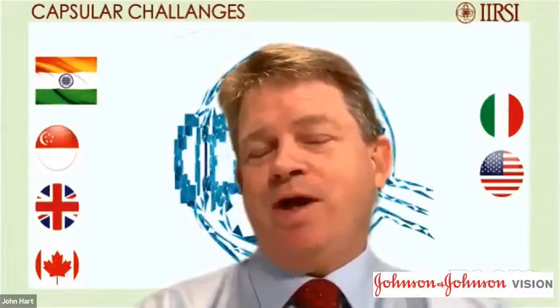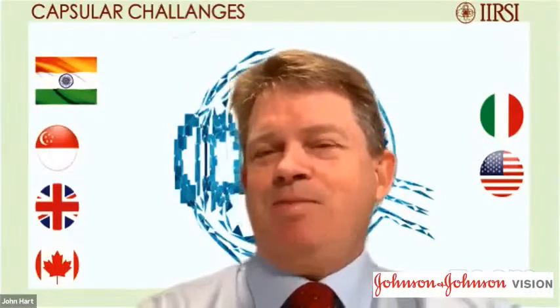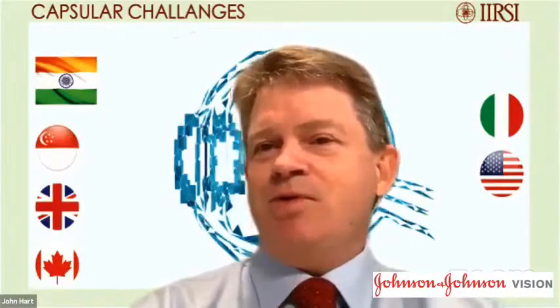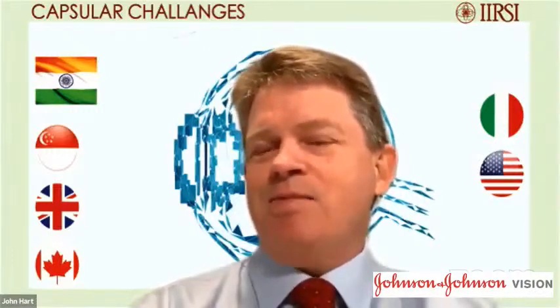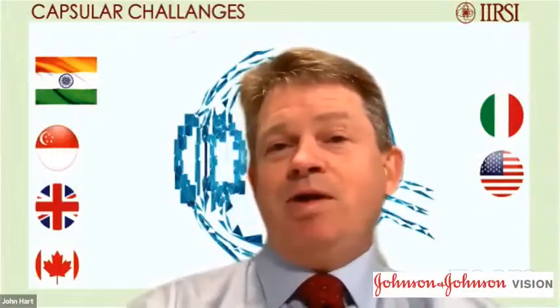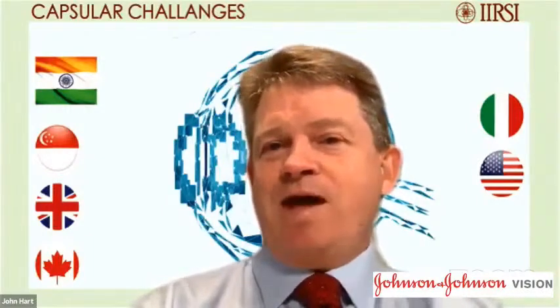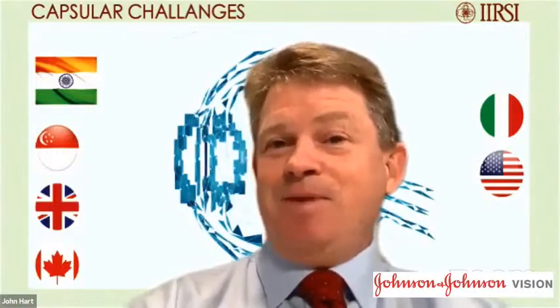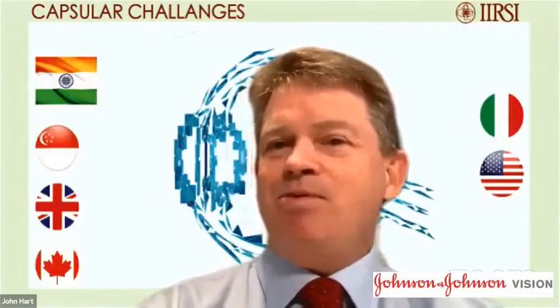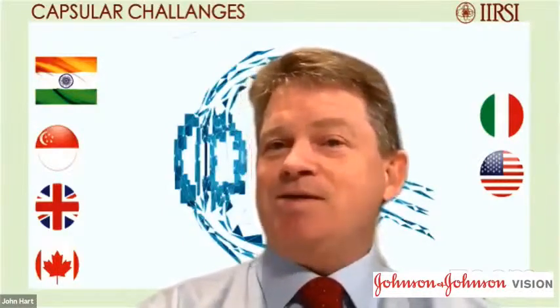Again, this is a beautiful case, and things went absolutely well. Just a couple of things come up. I think the underlying theme of this entire conference is, let's keep this a closed system. Let's keep the pressure normal in the anterior segment. Every single case that we've seen goes back to that, and it's really, really critical, and how this case was managed so well. I think once we get away from that is when we have problems. And we didn't talk about that because all the cases went well. But I think that is the underlying issue here. Keep normal pressure in the anterior segment. It keeps the vitreous back. It keeps everything up in the front. And it makes life a whole lot better.